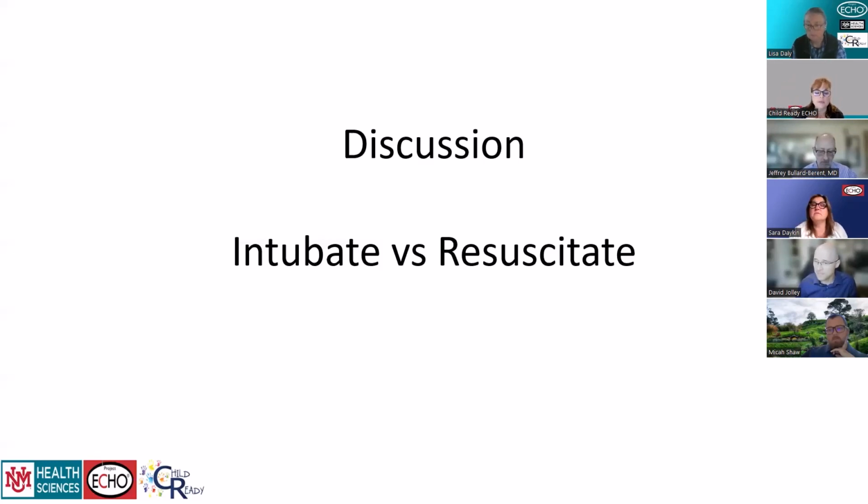Thank you. I just want to follow up on the question with regard to the ALS ambulances and the tiny LMAs. Currently there's a national initiative for EMS services to really start thinking about being pediatric prepared. There is a checklist available online of all the needed equipment to be pediatric prepared, and the different LMA sizes are on that checklist. A couple of people on the call are EMS, and I'm not sure if they would be willing to answer in the chat box or go off mute. In my experience talking with these services, the frequency of pediatric calls is so few and far between that sometimes they don't think to be prepared in this manner. So that's why we're really trying to push that.